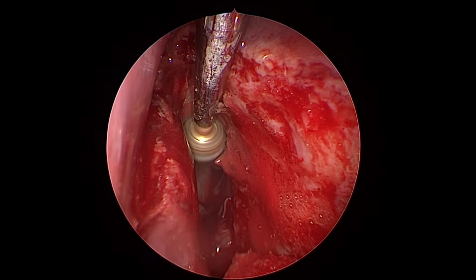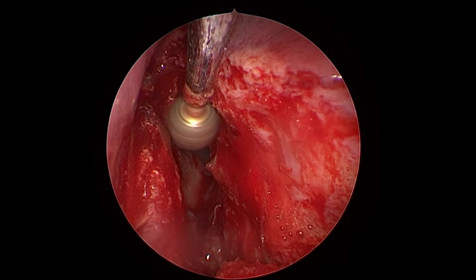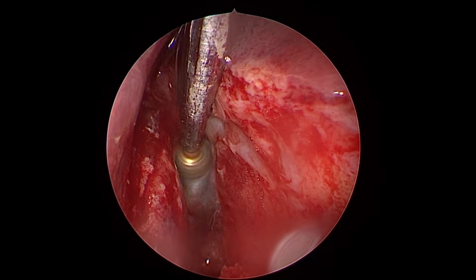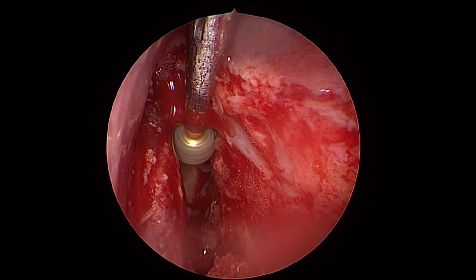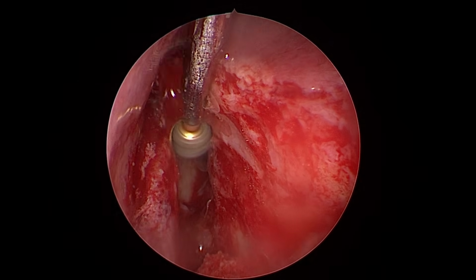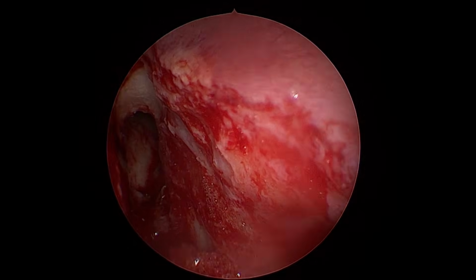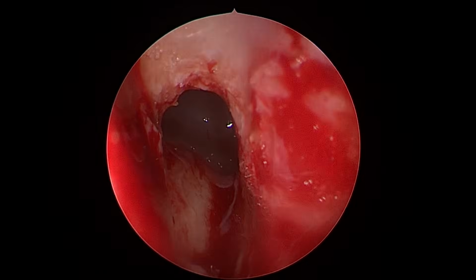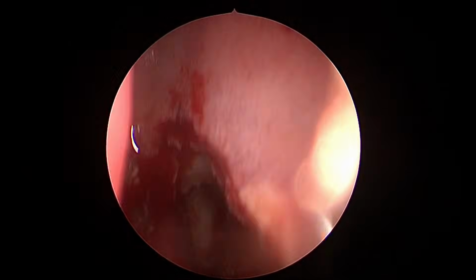I am not doing a classical draft. Just showing you, in case required, you can do a minimal drilling. But is this drilling required in this given case? Yes, it is required a little bit because my frontal access is still narrow. This is a revision case. We can't take a chance. This ostium should not get blocked and there is no harm in doing it. Why take a chance for this poor fellow for a third surgery?